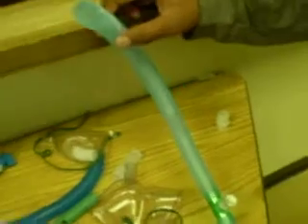All right, the next one we're doing is heated aerosol T-piece, and it's basically the same thing as the trach collar. The only difference is, instead of having your trach collar right there, you would have a T-piece — or to be technical, a Briggs adapter.